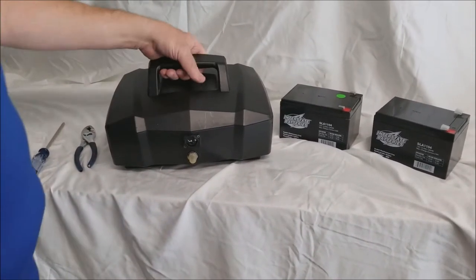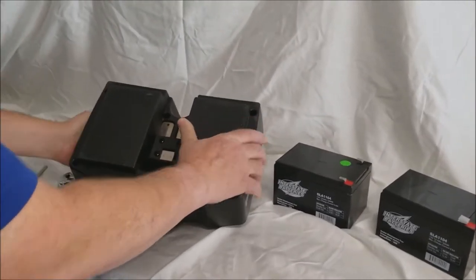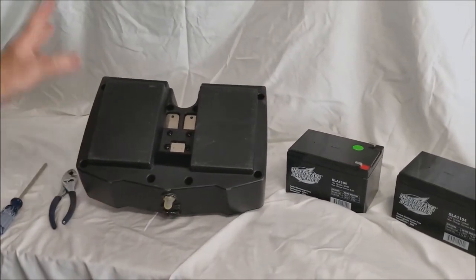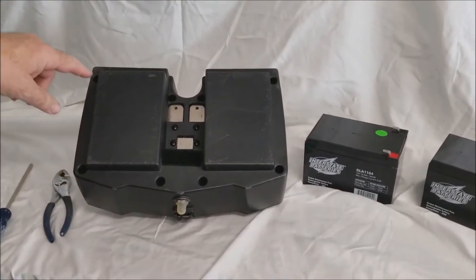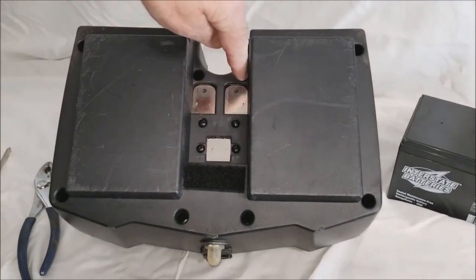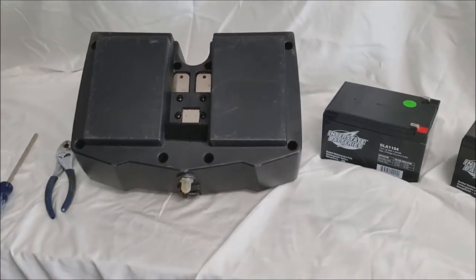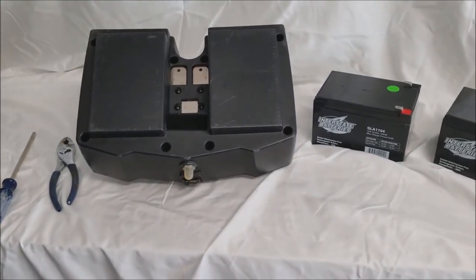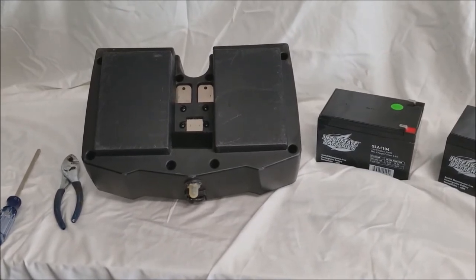So for starters, we're going to take the battery pack and we're going to turn it upside down. You might find that you want to lay it on a cloth, but you can do this at the kitchen table. And you'll notice that there are 8 holes here, here, here, here, here, here, here, and here, in which there are screws. Those are Phillips head screws. And once we take those screws out, the top of the battery box will open up very easily.